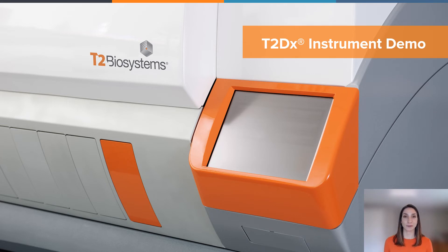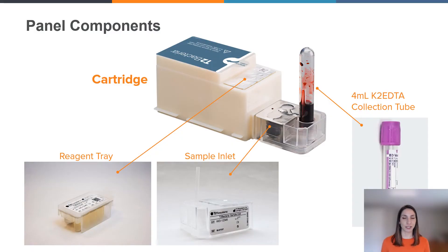I will now get into the T2 DX instrument demo. We'll need a few things to help us — I am demoing today the T2 Bacteria test, also shown on the screen. First, you'll need a four milliliter draw of whole blood in a K2 EDTA collection tube. This can be drawn by the phlebotomist or patient bedside, as long as it is collected using aseptic technique, concordant with the blood cultures being collected from the patient. Next, you will need a cartridge, which contains the consumables needed to run the test. You'll also have a reagent tray, which contains the reagents within each well. And lastly, a sample inlet, which is used to disperse the sample from the K2 EDTA tube into our sample reservoirs, which will then be pipetted from once the panel is on board the instrument.